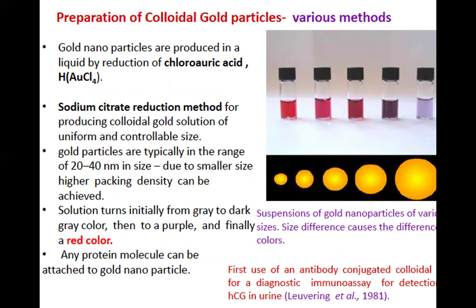The preparation of gold nanoparticles has been published a lot, but we can share with you tomorrow the formulation that has been used, and based on our observation, 40 nanometer is the best for you to get the best test line reading.